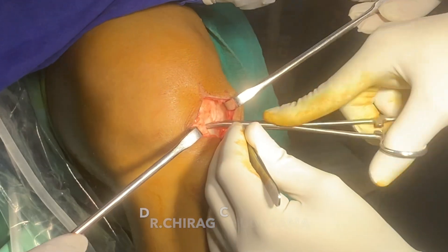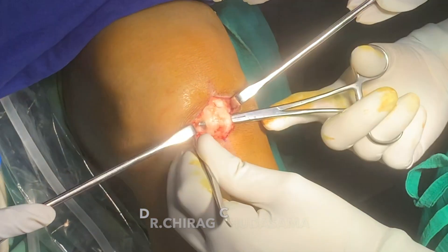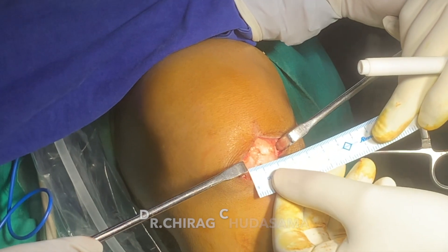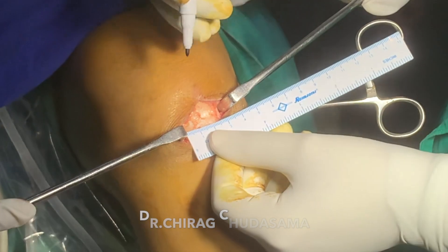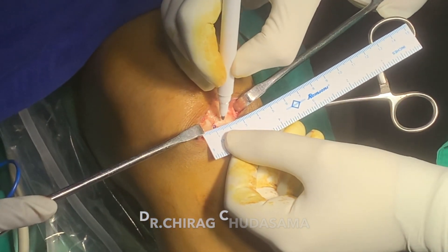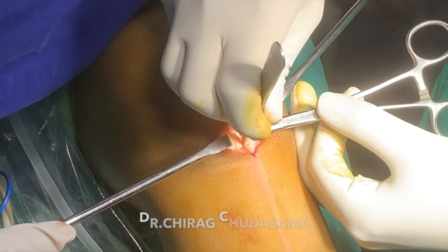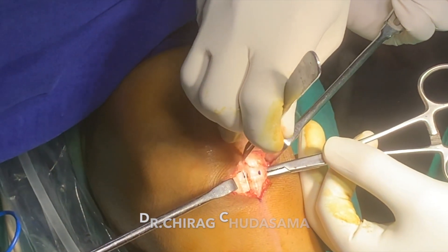After retracting the peritenon on both sides, we identify the patellar tendon using artery forceps just below the tendon, separating it from the surrounding fat pad. We just need to measure the width of the patellar tendon. Ideally the central third of the patellar tendon should be harvested. This is almost 3 cm width of the patellar tendon, so we will harvest the central 1 cm — 10 mm of patellar tendon.